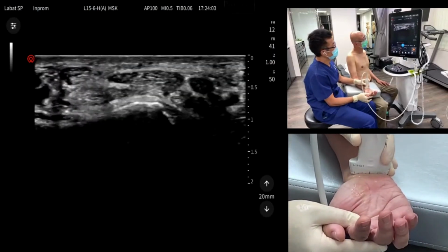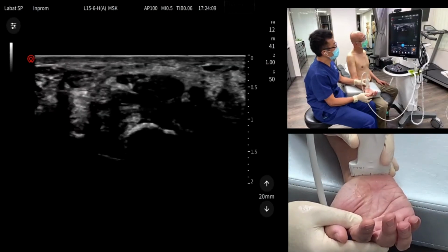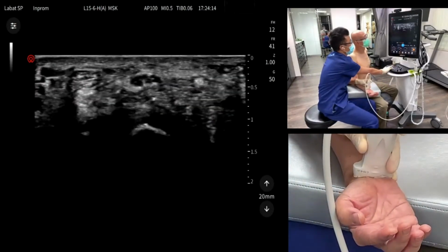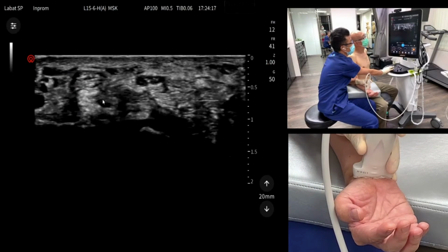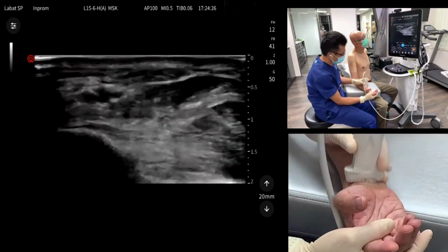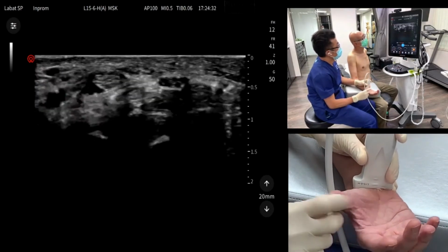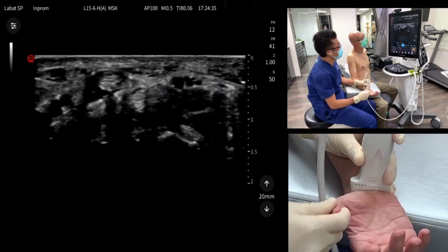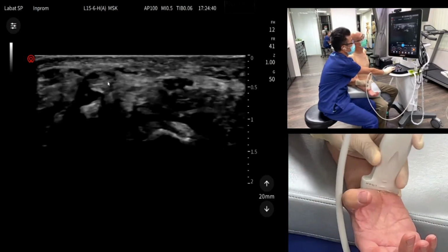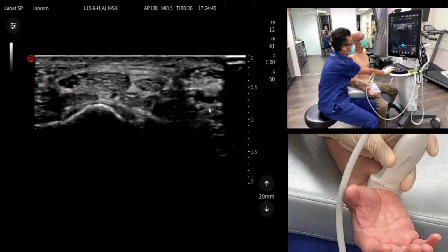And then to be right at the distal radioulnar joint and to surface, and it will go underneath the flexor retinaculum here. And this is the flexor retinaculum. And then with all these flexor digitorum tendons and with the flexor pollicis longus tendon. And outside the flexor retinaculum, you also have the flexor carpi radialis. And on the ulnar side, you have the ulnar artery and ulnar nerve.